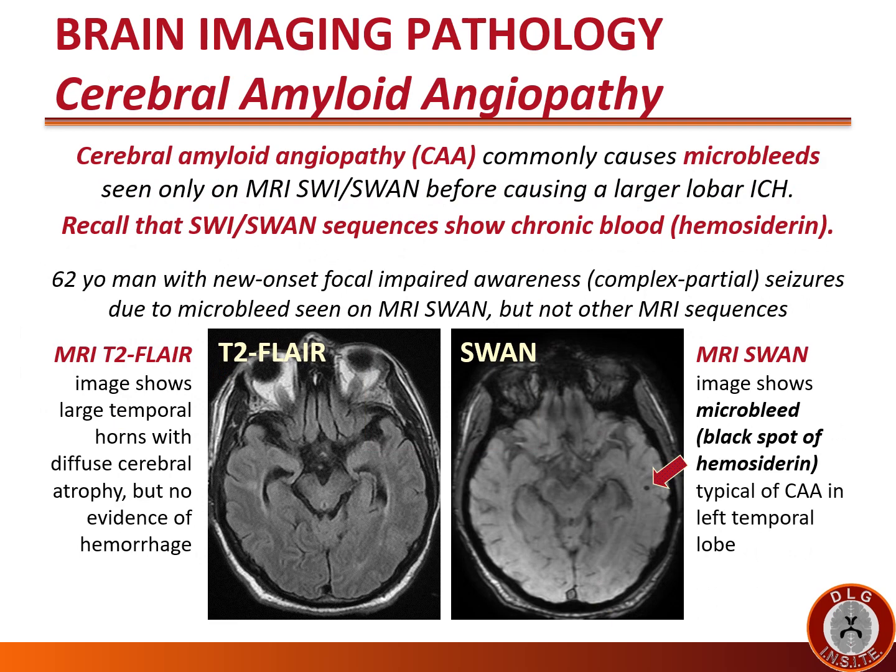Cerebral amyloid angiopathy is the most common cause of lobar hemorrhages in elderly patients, particularly those with dementia or mild cognitive impairment. It commonly causes microbleeds seen only on MRI SWI or SWAN sequences before causing a larger lobar hemorrhage. SWI/SWAN sequences show chronic blood — hemosiderin — for the life of the patient. In this case, a 62-year-old man has new-onset complex partial seizures due to a microbleed seen on MRI SWAN but not on other MRI sequences. The MRI T2 FLAIR shows large temporal horns consistent with diffuse cerebral atrophy and possible dementia, but no hemorrhage, whereas the MRI SWAN shows a microbleed — a black spot of hemosiderin — typical of cerebral amyloid angiopathy in the left temporal lobe.